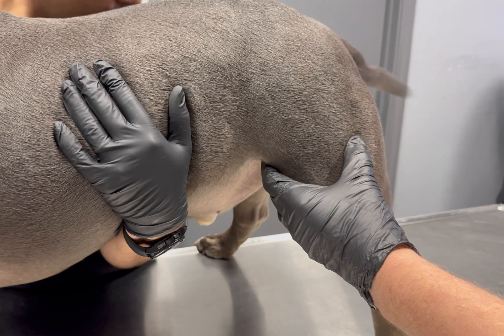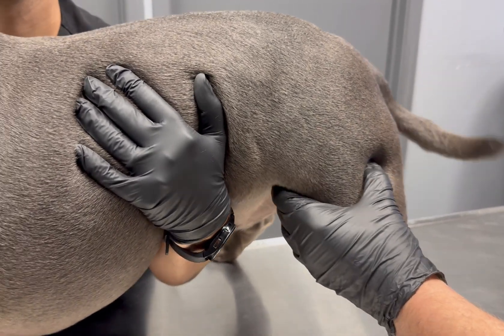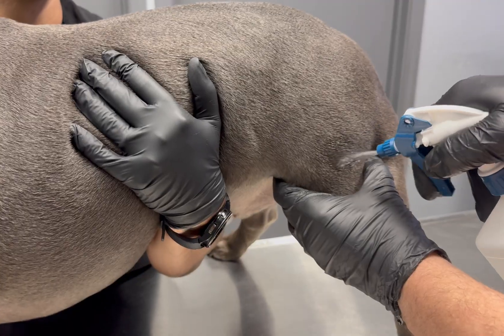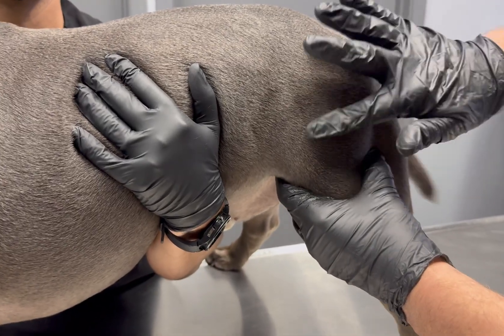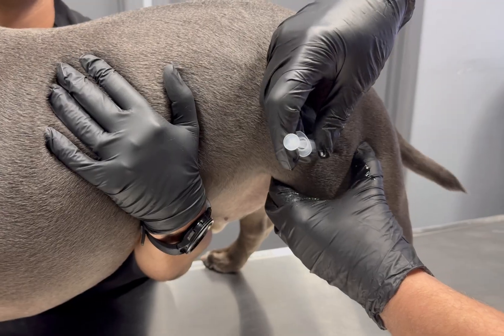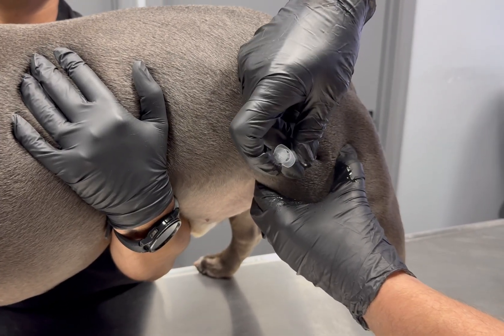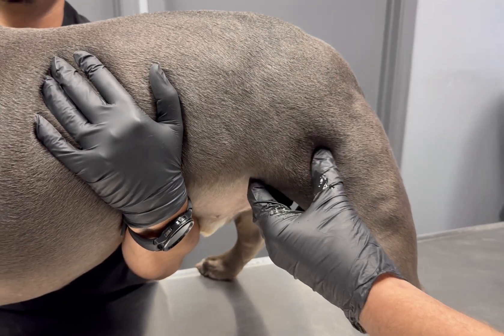So many times we'll come here. I just want to show that we can come here, give a little bit of alcohol here, and then come in and go directly into the muscle there and inject. And it's good.